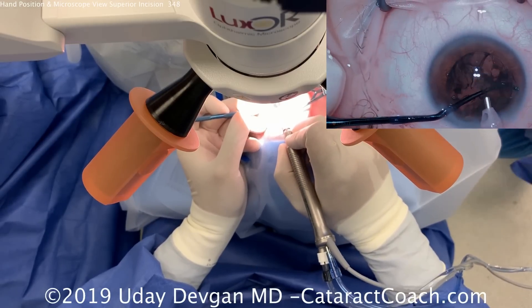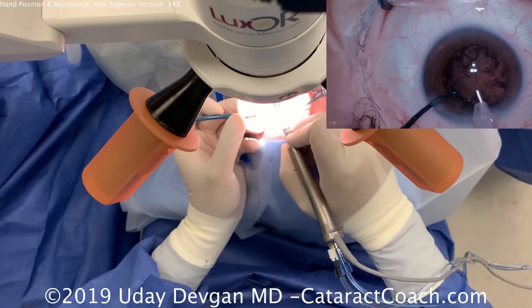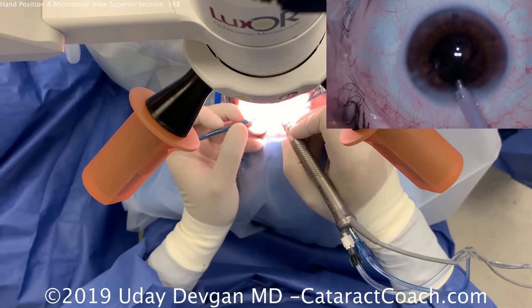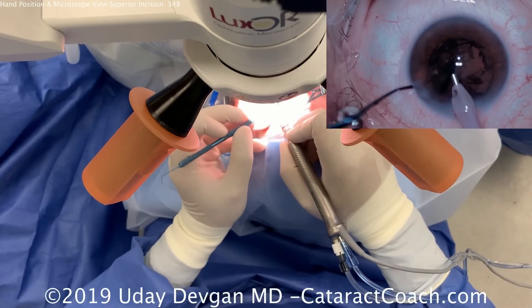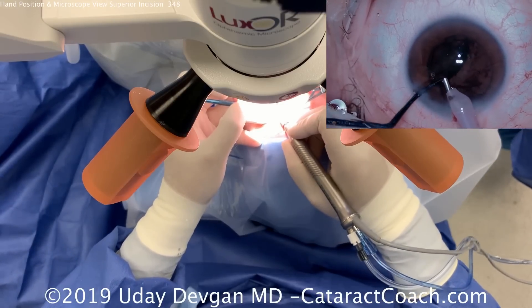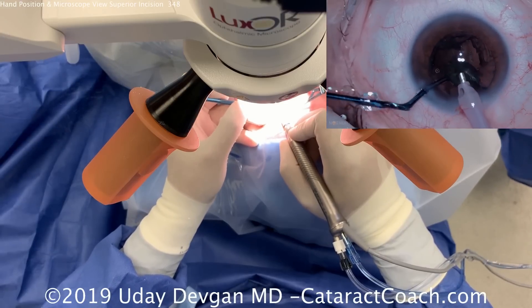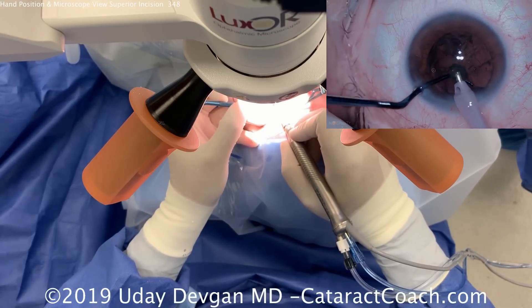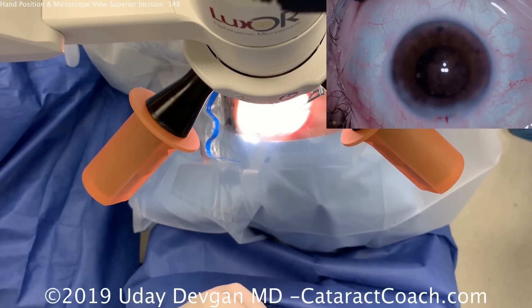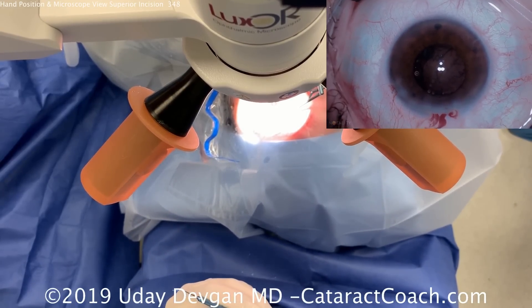The last little bit of nucleus is being removed, with the chop in the protective position. Look at the hand position — each hand like a pencil. One last small piece of nucleus; use the chopper and the FACO probe just to aspirate that slowly, with the chopper in the protective position. Both hands are resting on the patient's head or face, with the pinky and ring fingers doing the resting. As you can see, the pupil has come down more in this case, so it was a good thing that we brought the nucleus up out of the capsule bag.